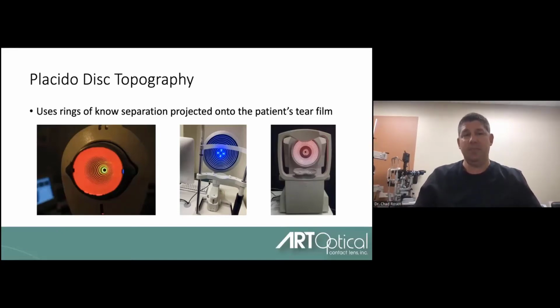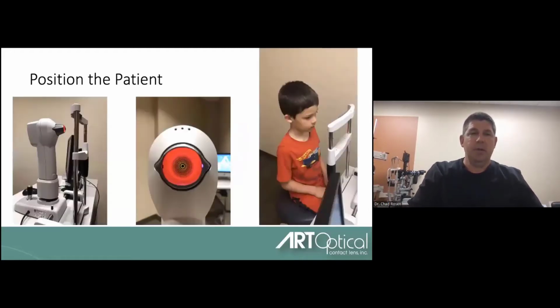And that helps the topographer get in closer and be able to get images without getting shadows on them. The Medmont also has similar issues, so we'll talk about that here in a second. So here's the picture of you from the side. You can see obviously the cone of the Medmont is much smaller than those other instruments. It needs to get in very close.